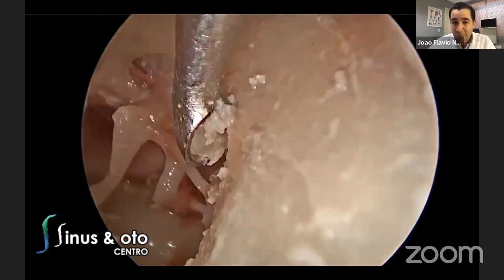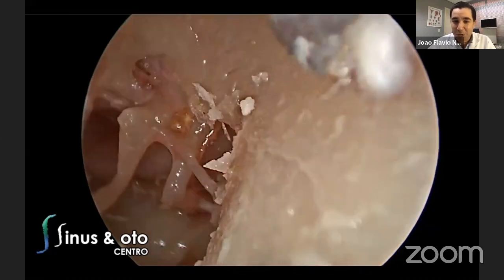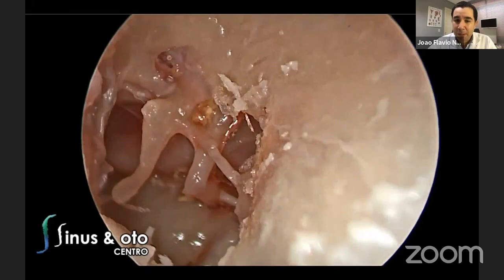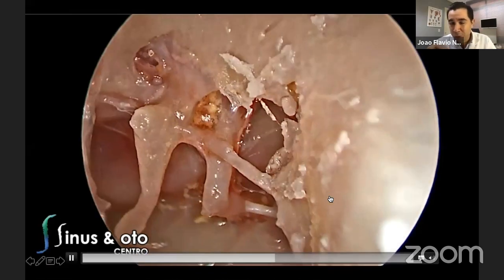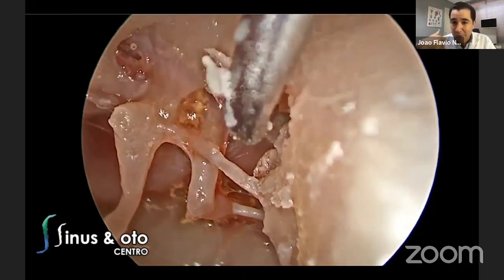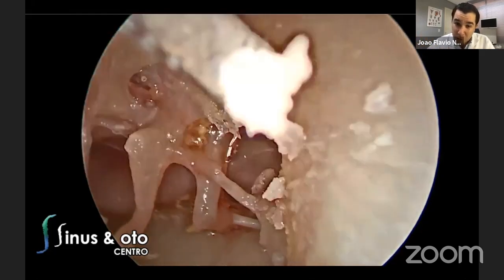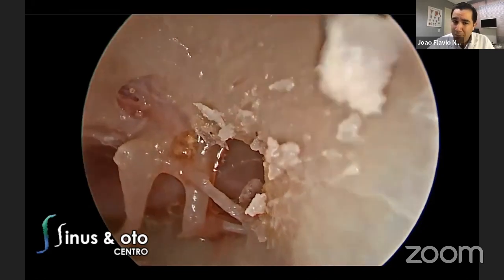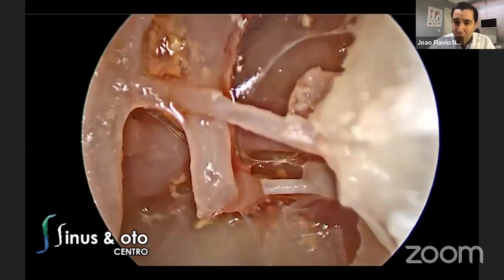And the cholesteatoma have sometimes already done some of this bone work to you because it erodes the bone. So it can be a little bit easier. You can go from here to the articotomy all the way to the mastoid tip. But I think it's not a clever move to do this inside-out mastoidectomy because you end up losing a lot of time. You just have one hand if you don't have a holder to do this. And of course, at the end, you will need to reconstruct.